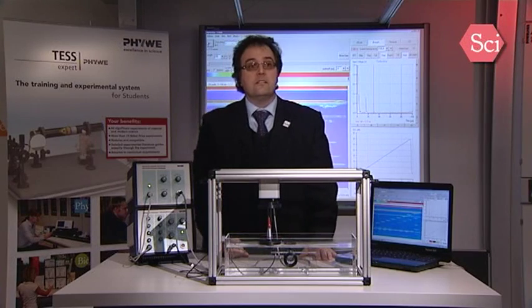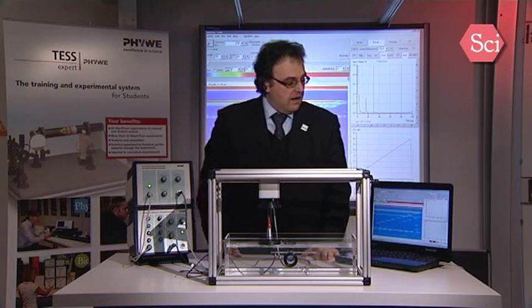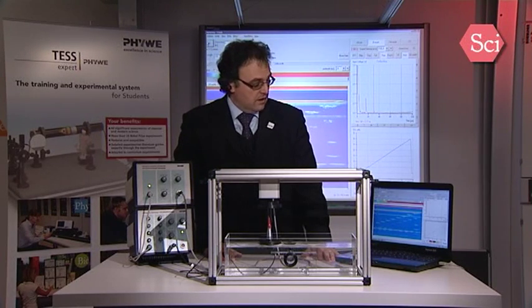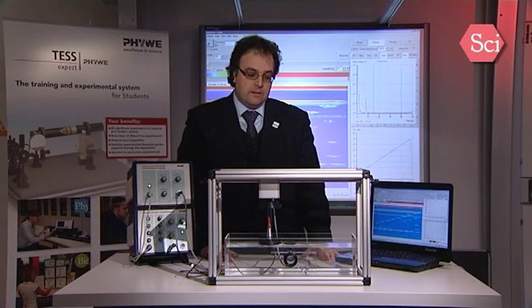So once the measurement is done, you can see here the image of this block, and all the other functions are similar to the function of the TM mode. So that will be the B-scan with mechanical scanners, and now we can go on to a typical medical application, the CT scanner.